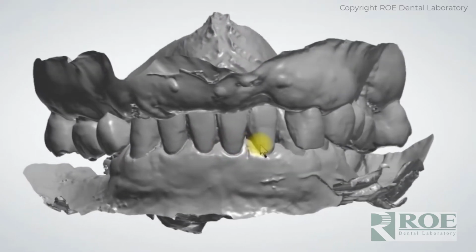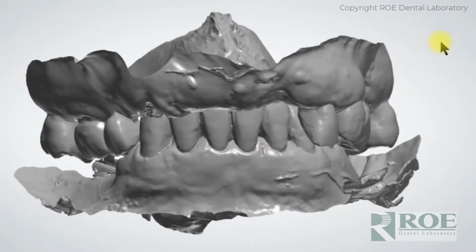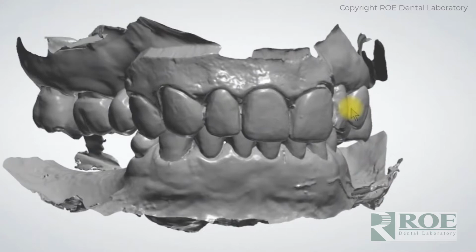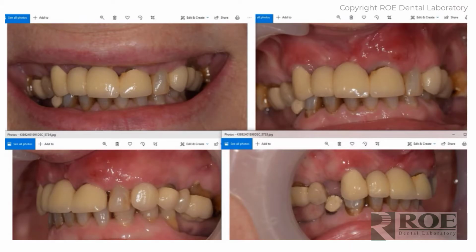So this patient is severely closed, deep class 2, and really no centric contact. Fortunately, the patient had a partial, and so we used the partial to set the bite. So there are 3 scans: upper, lower, in-centric bite, and then upper, lower with the bite with the partial appliance in place. All right, so photographs, CT scan, STL files, and please, on records, call us anytime there are any questions, anything that deviates from the norm, or if it's norm, call us because the records are just so important.